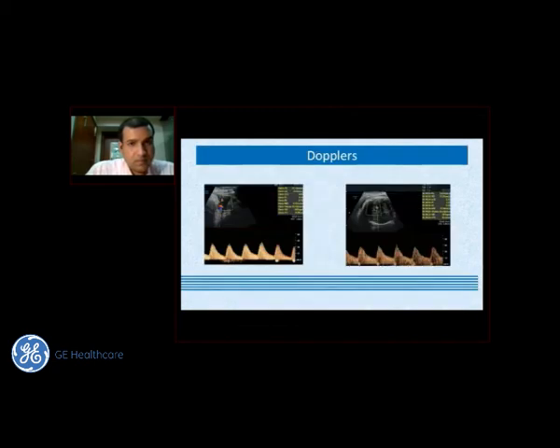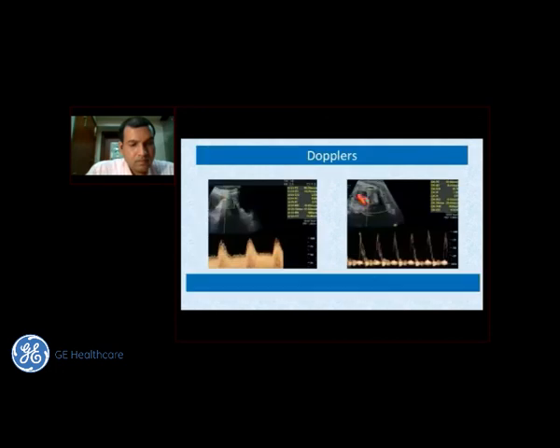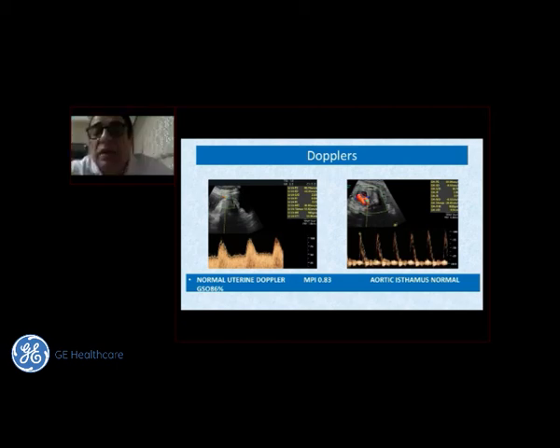And if this was on the 10th centile, right? Although it is crossing centiles and it is about 30 weeks, I would look at the CP ratio, and if all the Dopplers are normal, then I would just wait and watch. But if there's anything abnormal in the Dopplers, I would increase my interval of monitoring, and delivery will be decided on the basis of how the changes in Doppler happen, or if the fetus is falling below the 3rd centile.